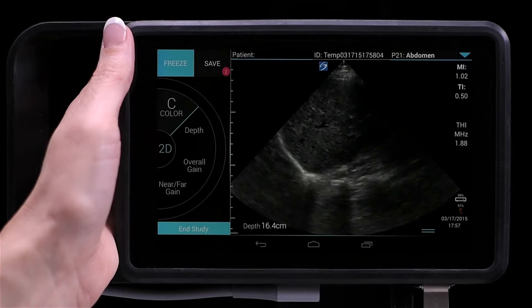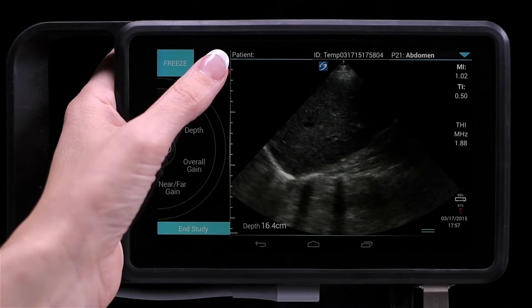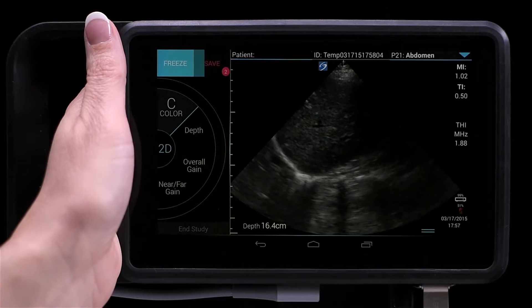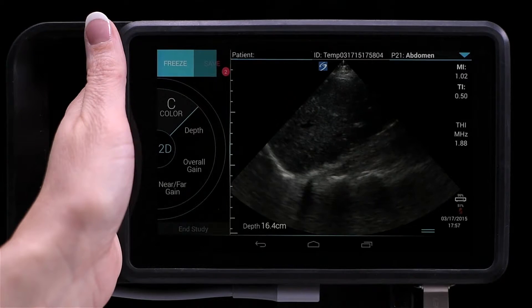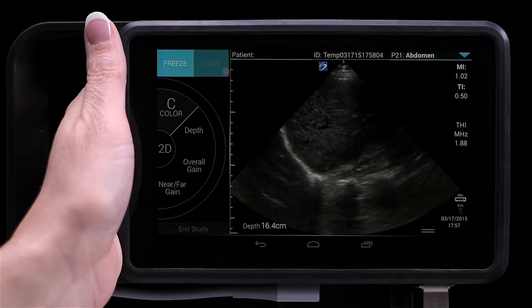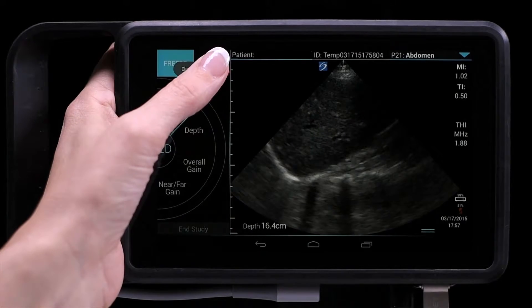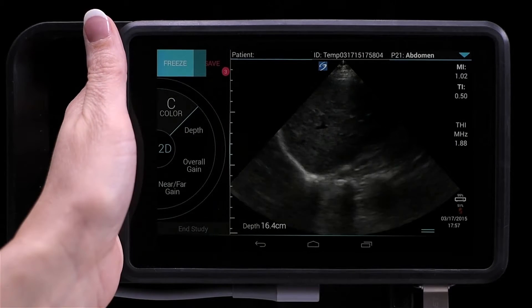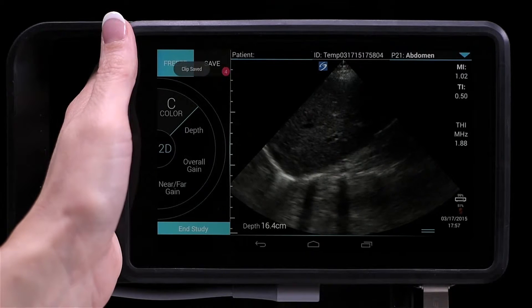To take a clip, press and hold the save button. The clip will record for the length of time you've set on the preferences page — in this case, six seconds. If you want to stop the clip earlier, just tap Save again.